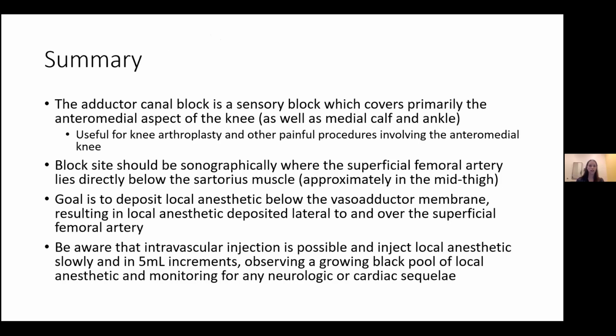So overall, the adductor canal block is a sensory block which primarily covers the anterior medial aspect of the knee, as well as the medial calf and ankle. It's quite useful for painful procedures of the knee, including arthroplasty. The block site is sonographically where the superficial femoral artery is right below the sartorius muscle. It's usually in the mid-thigh, but again, you can't necessarily find it from landmarks alone.